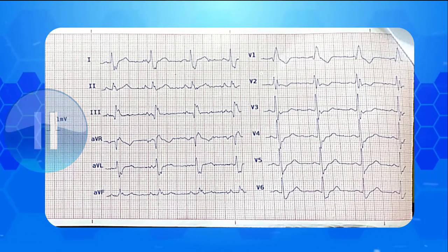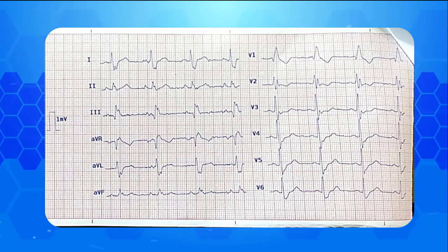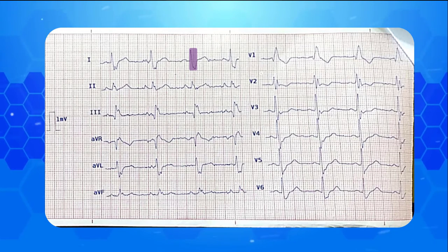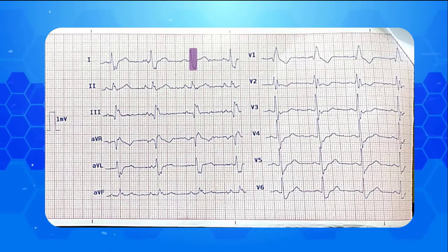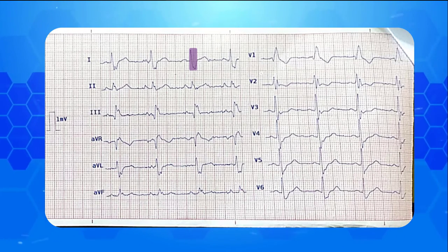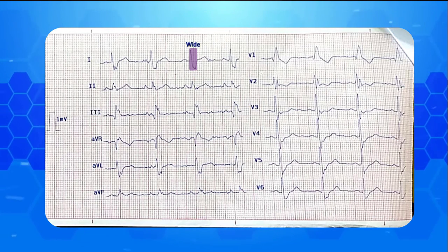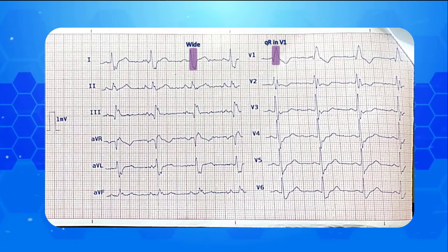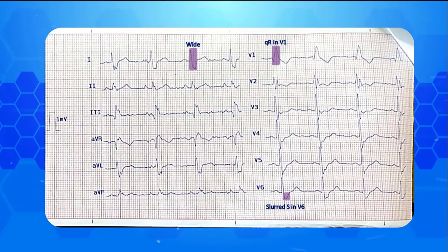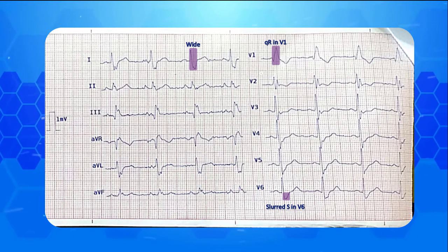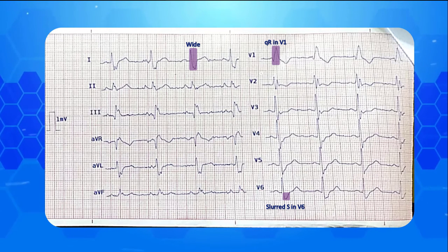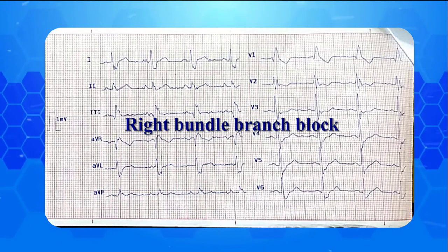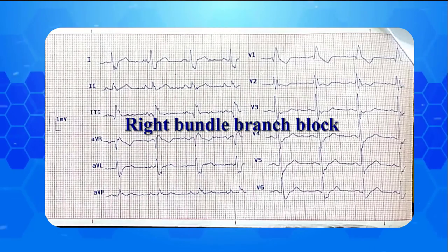As you see, the QRS complexes are 3.5 small boxes, so the complexes are wide. There is a QR pattern in V1 with concomitant slurred S in V6. Therefore, this EKG is demonstrating RBBB as well.